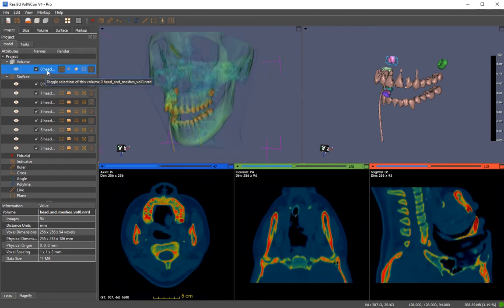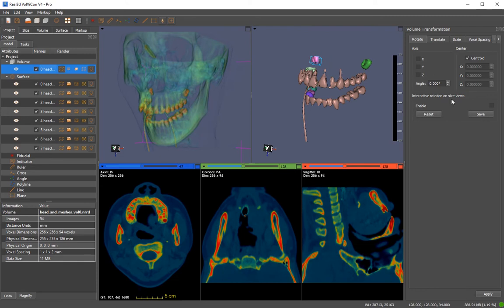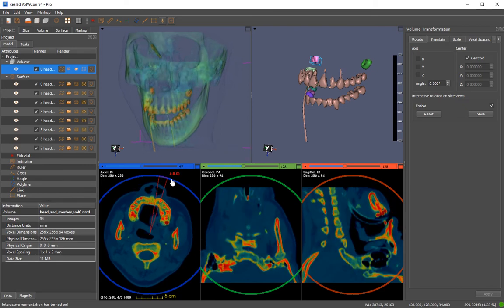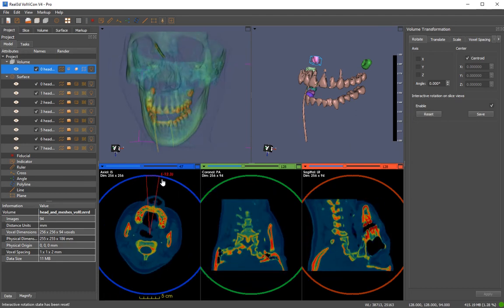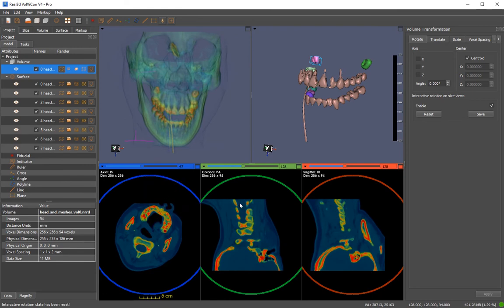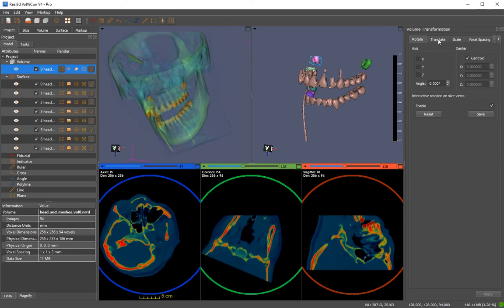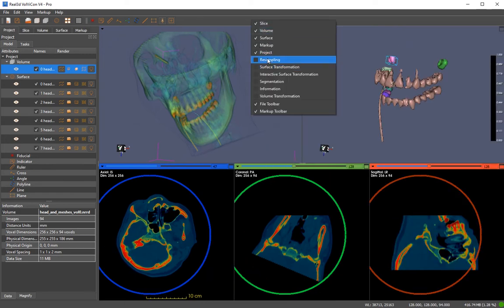Let me perform transformation. Go to Tools > Transformation, turn on the interactive transformation, and you have this transformation interface on slices. You can reset it. If you want to move further on different slices you have to save it and then perform rotation along other axes. These are the basic transformation tools. We have now covered resampling and volume transformation; surface transformation works the same way.